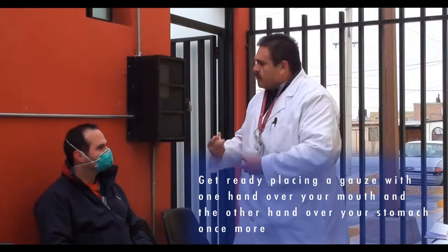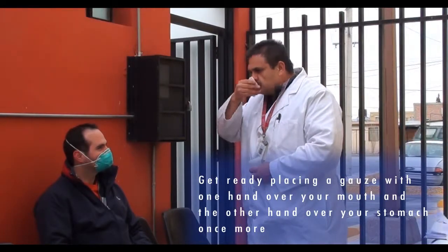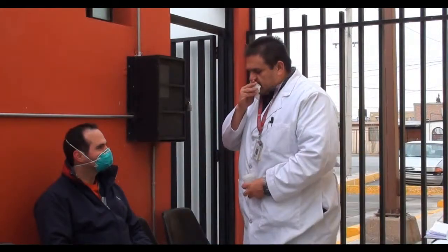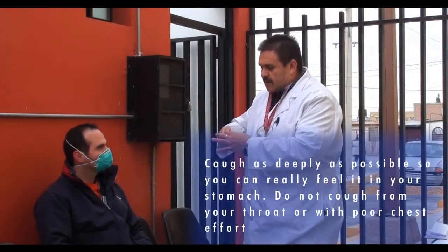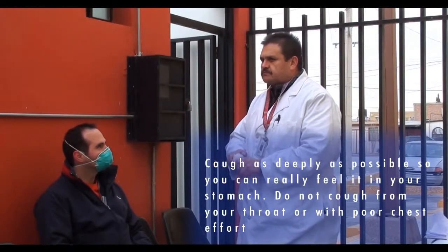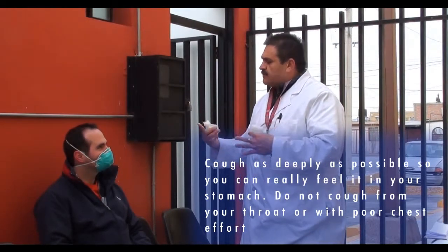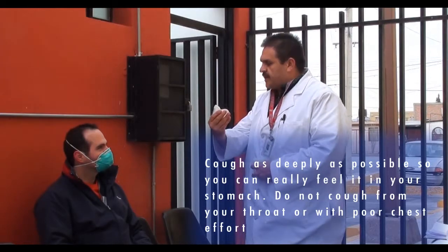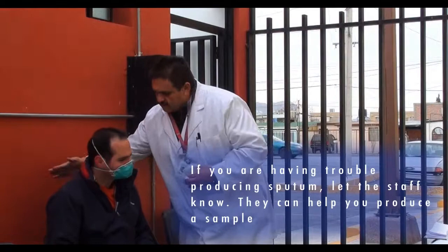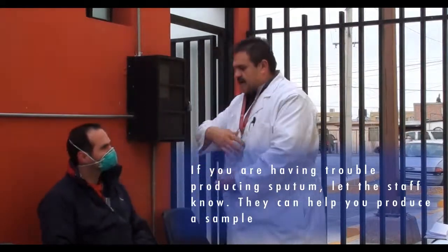Get ready, placing a gauze with one hand over your mouth and the other hand over your stomach once more. Cough as deeply as possible so you can really feel it in your stomach. Do not cough from your throat or with poor chest effort. If you are having trouble producing sputum, let the staff know. They can help you produce a sample.